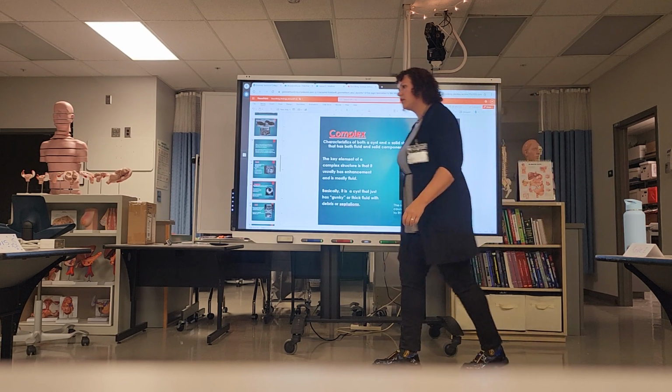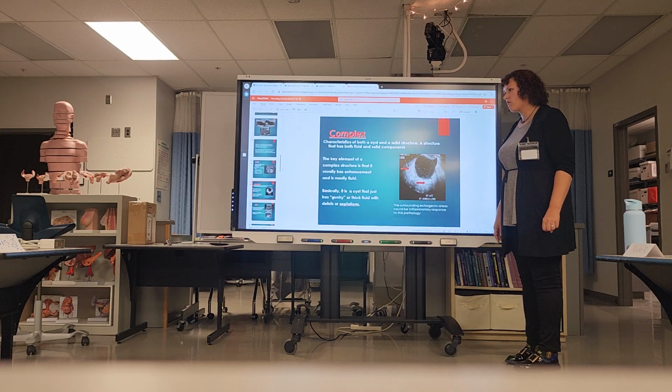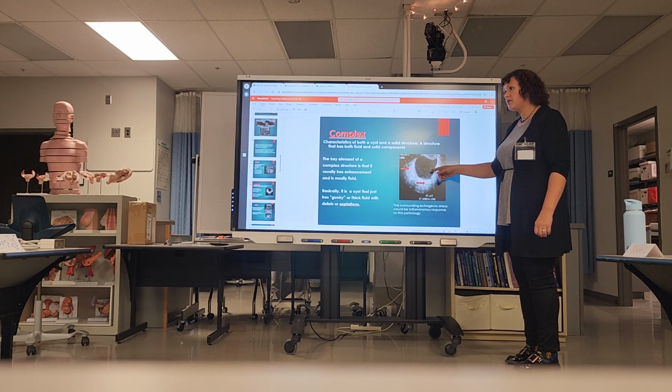I have a question about the blood. So when it starts to sit there and form the red, is it the blood starting to clot? Mhm. Yeah. Have you ever seen an ovarian cyst with the blood clots? Is that weird? This hemorrhagic cyst? Yeah.